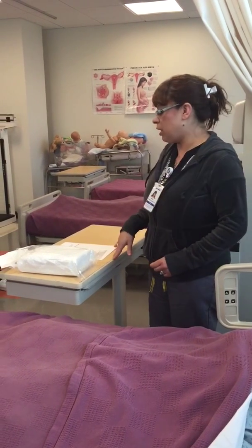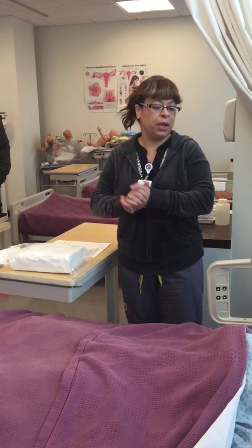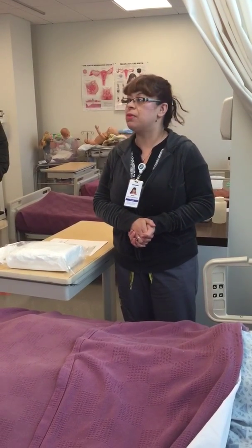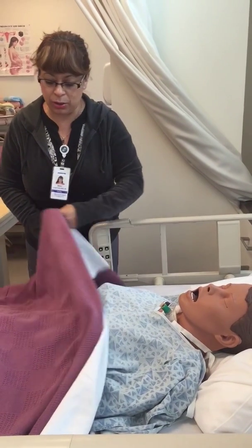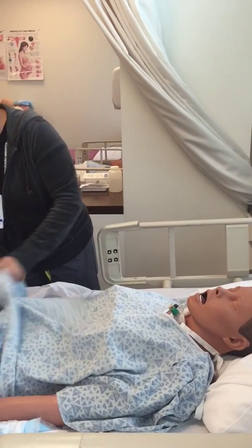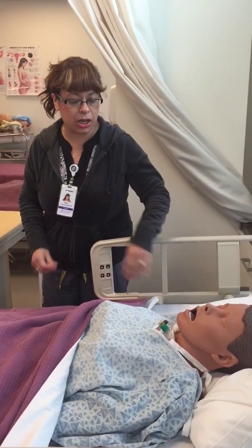So I checked my order. Now I want to come and identify my patient, but before coming in, I did my hand sanitation, and I want to come and introduce myself to the patient. Hi, Mrs. Well, I don't know if she's a Mrs. or a Mr. Let's see. Mrs. Okay. Mrs. Smith, my name is Sandra, and I'm going to be your nurse today, okay?